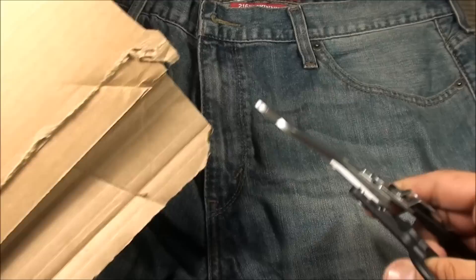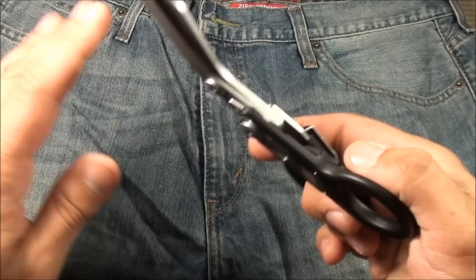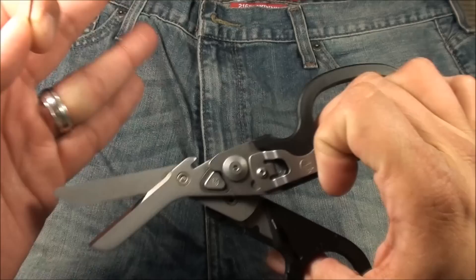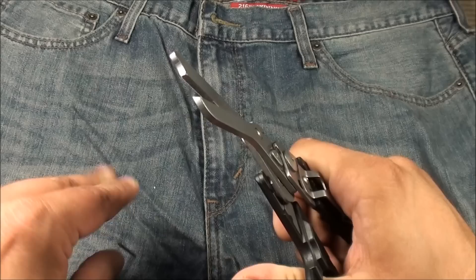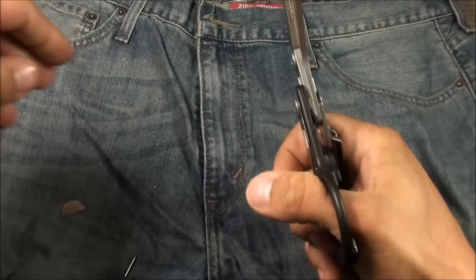This thing is mainly designed to cut through clothes for medical purposes, especially if someone's injured — so for a pair of jeans, for example. But I just wanted to show you some of the other things it can cut through. Like the ring cutter we talked about earlier — I don't want to cut my ring off because I'd get in big trouble. But things like a little nail, and let's also look at some pennies. Don't worry, these are just Canadian pennies.